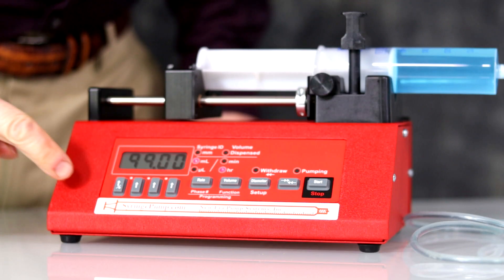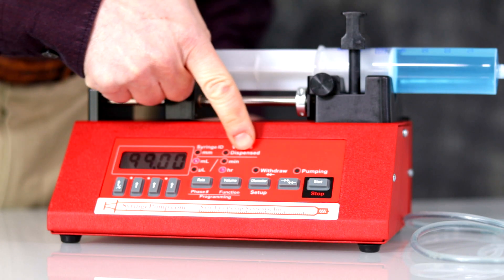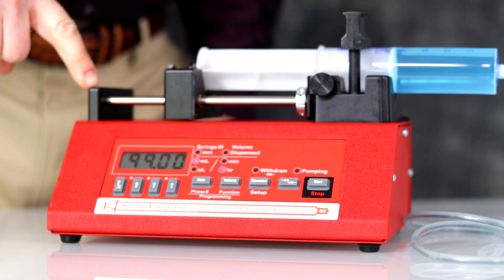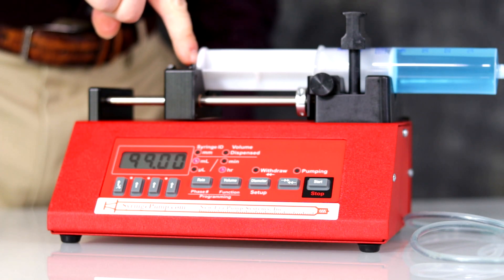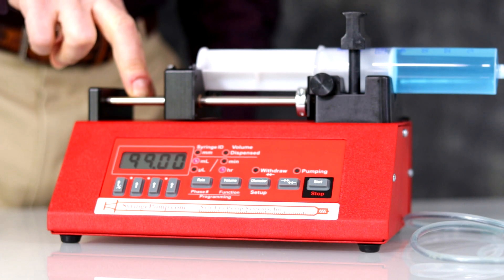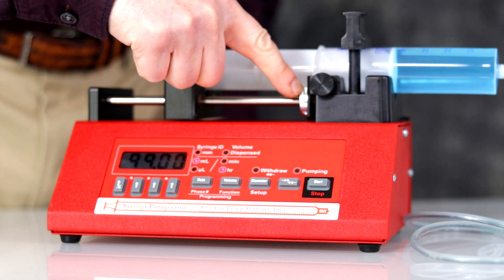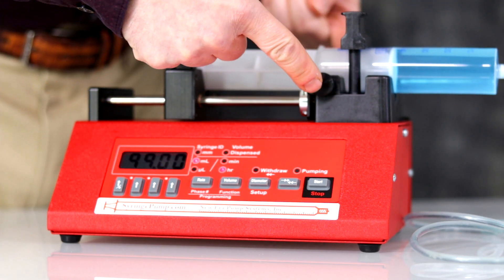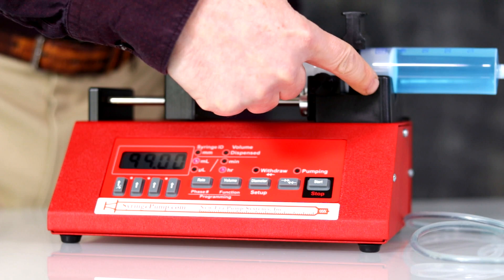Identification of Parts, Front: Keypad, LCD Display, LEDs, Syringe Pump Mechanism, End Plate, Pressure Block, Anti-Siphon Bracket, Thumbscrew for Anti-Siphon Bracket, 2 Guide Rods, Drive Screw, Collar Clamp, Syringe Flange Retainer Bracket, 2 Thumbscrews, Syringe Holder Clamp, Syringe Holder Block.